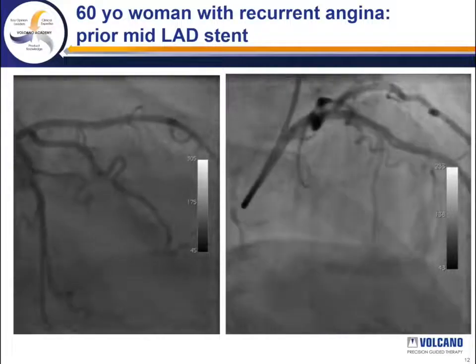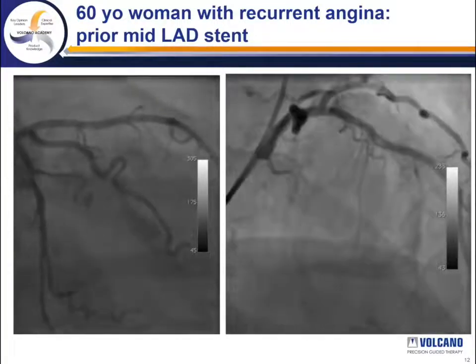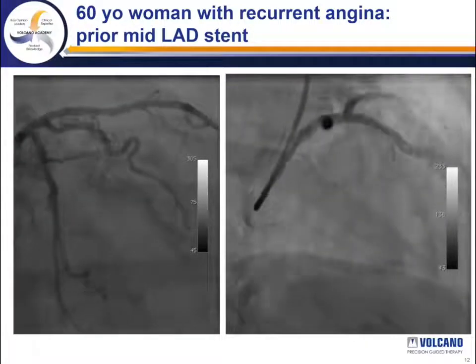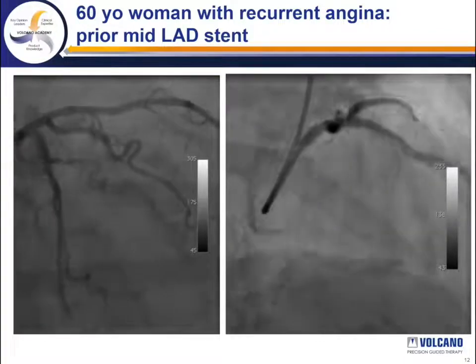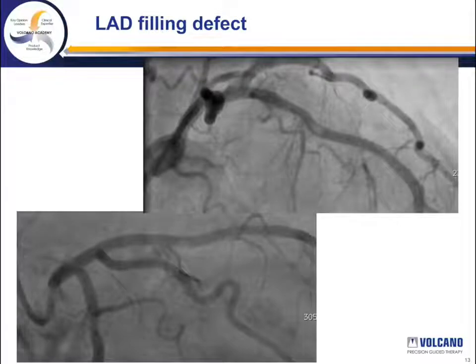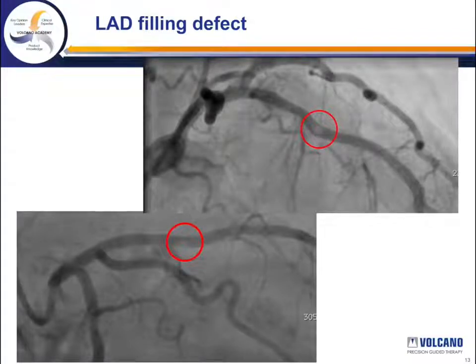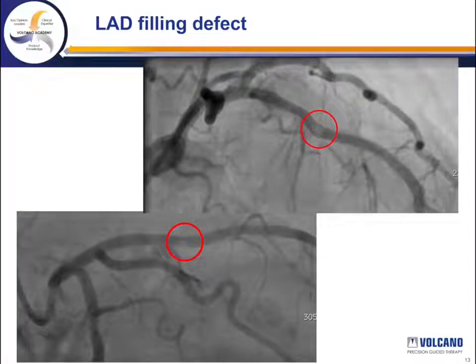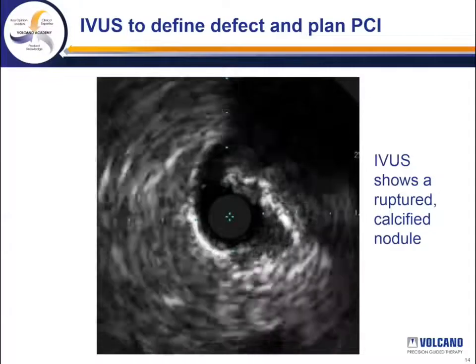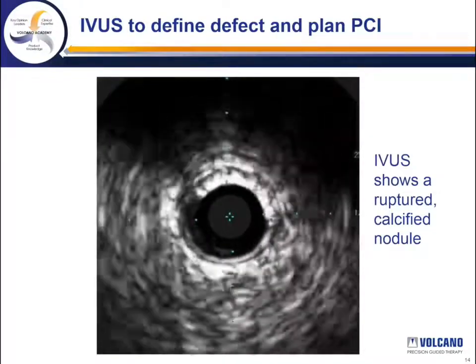Here's a 60-year-old woman with recurrent angina. She's had a previous stent in the mid left anterior descending, and this filling defect is just proximal to that previously placed stent. The lesion has the appearance of thrombus with new onset unstable angina, but in my experience these lesions are often not thrombus but in fact calcium. Intravascular ultrasound shows a ruptured calcified nodule in that portion of the vessel.